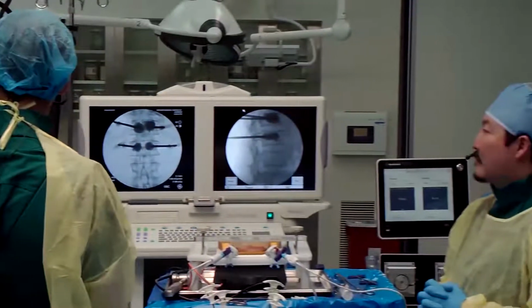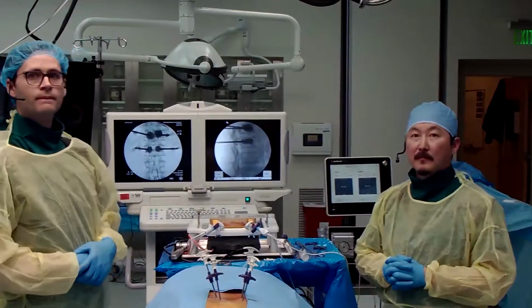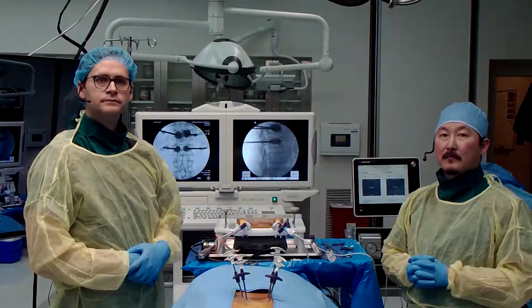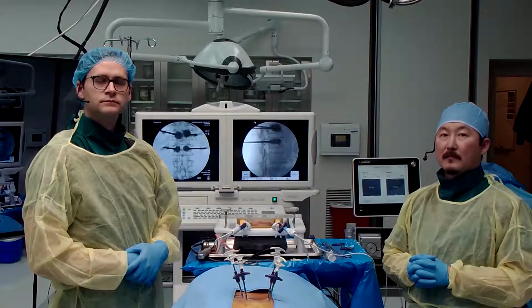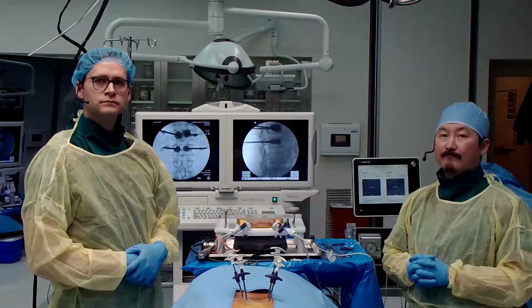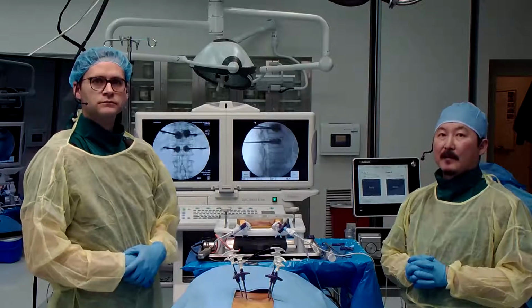Absolutely. Just a few comments. If you look at how this procedure was done, I think the two critical aspects of this procedure are, one, placement of the needle, and two, injecting the cement. If there's one thing I would emphasize about introducing the needle through the pedicle, it's that you don't want to put the needle through the canal, right? So your friend is the medial wall of that pedicle.